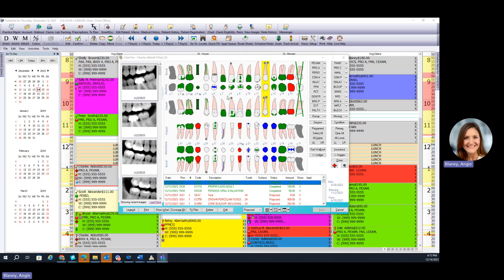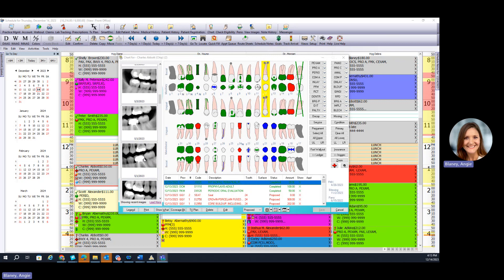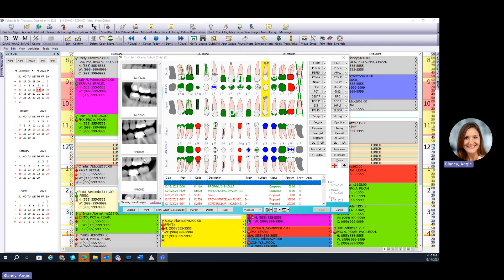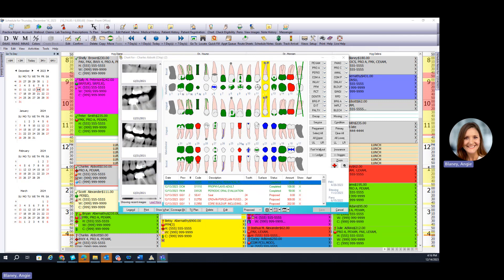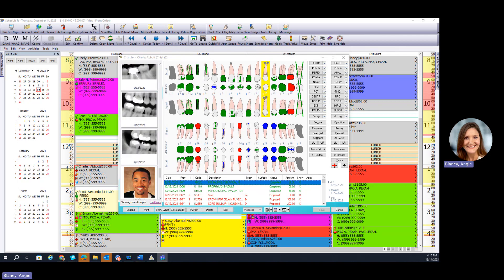I'm just going to run through the imaging aspect of EagleSoft here. On the digital odontogram, if you are using EagleSoft Advanced Imaging, you will see thumbnails appear on the left-hand side of any images taken, whether they be 2D images for your periapicals, bite wings, full mouth series, intraoral camera photos, or patient photos.